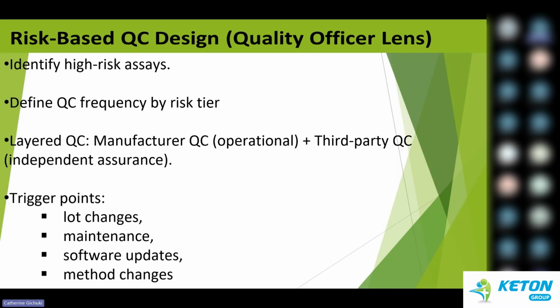So when we look at QCs, designing them on a risk-based platform, as QC officers, because I want us to look at this as QC officers, all of us are QC officers. We are champions of QCs in our own way. And wherever you've been assigned, of course, you check your competences and the reliability of everything that you're using for QC. So that is where you're a quality officer on your own. So when we look at how you make decisions and how to design your QCs, we will be looking at it in a risk-based manner.